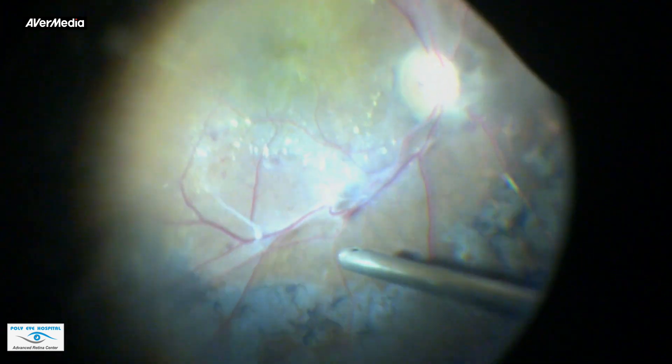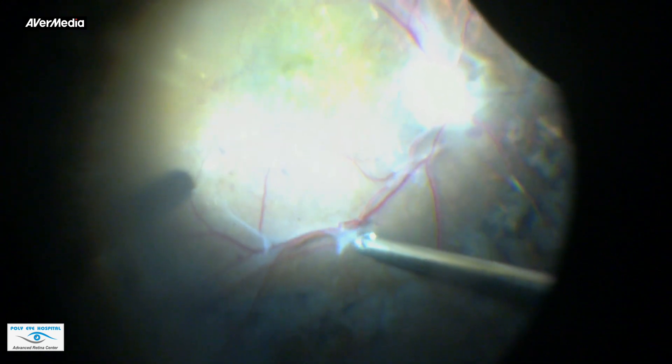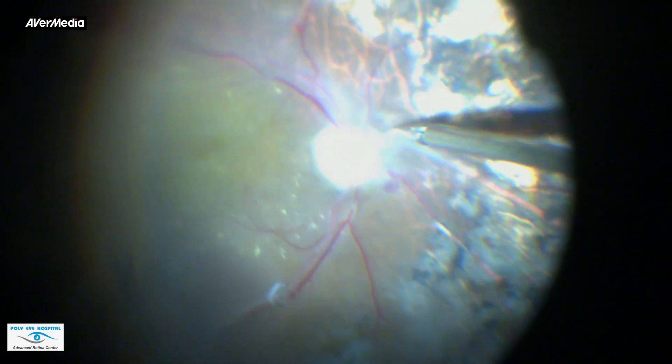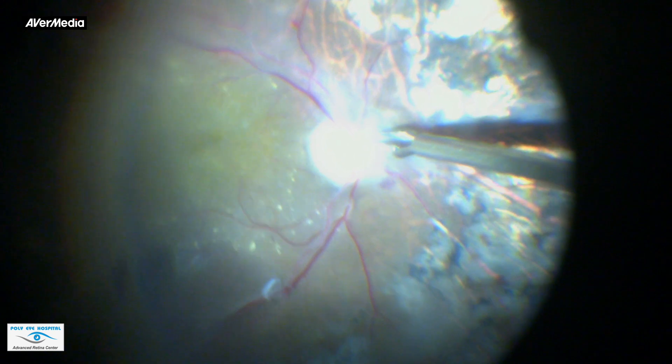After core vitrectomy, membranes were segmented and removed. Nasal proliferations were removed by pulling tangent to retina from disc using max grip.